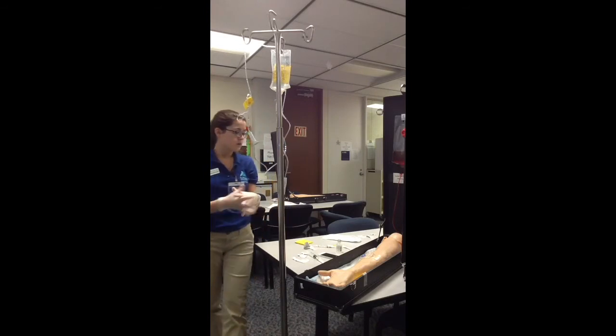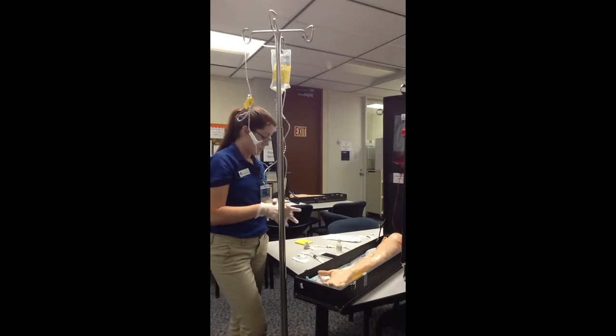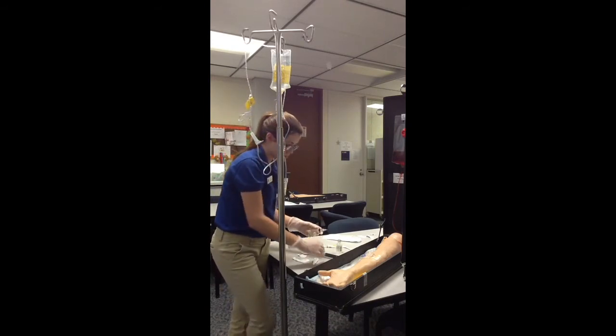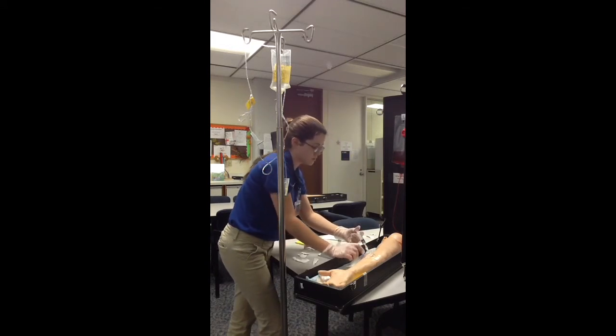Okay, so now I would document that, but before that I'm going to flush my IV. And I would flush using the push stop method of 3 milliliters.